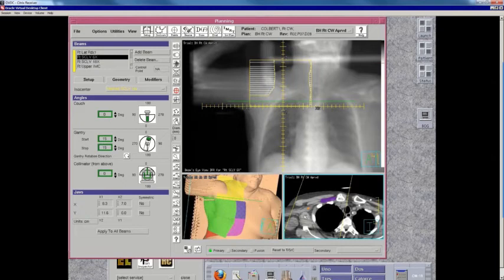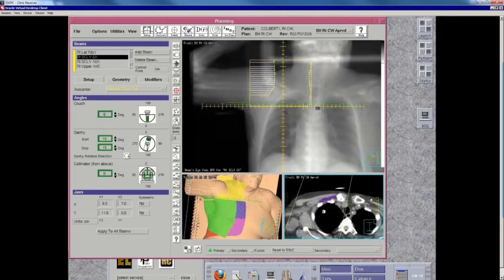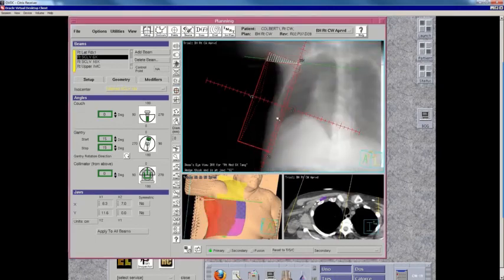So that's just a sort of a divergence to talk about nomenclature, but I think very helpful, hopefully, to understand differences in practice. So this is a great supraclav field. We're going to briefly look at the tangents. We kind of went over the meat of that before. So here's another nice tangent field.